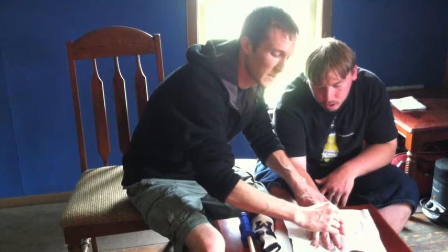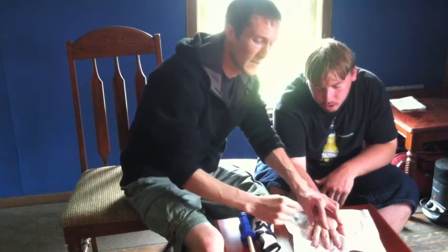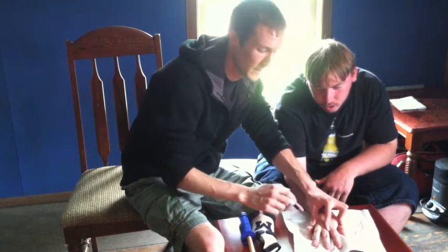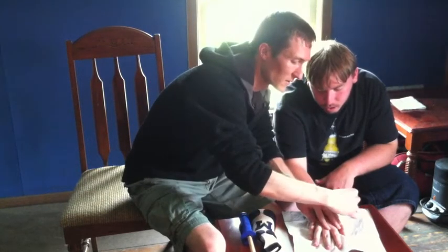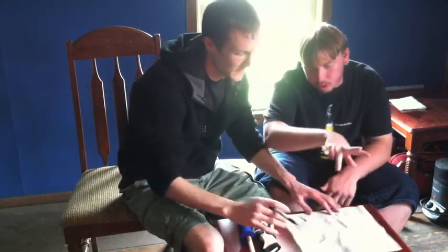Go into the second web space here, mark the MP joint. And then I'm going to go in the last phalanx right here and mark just below the MP joint right here. And then kind of trace along the location of the wrist here. Okay, Nick, you can go ahead and lift your arm up.